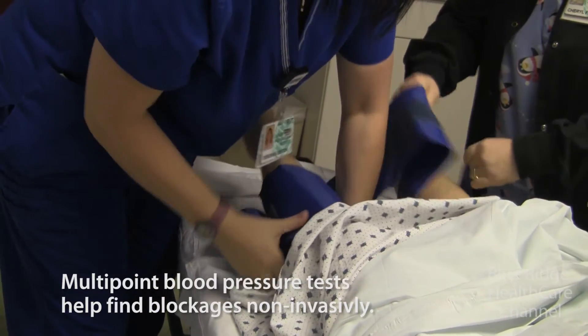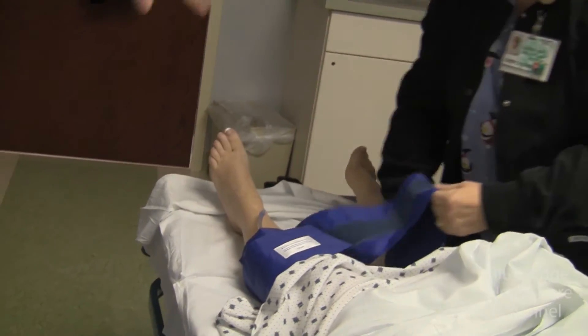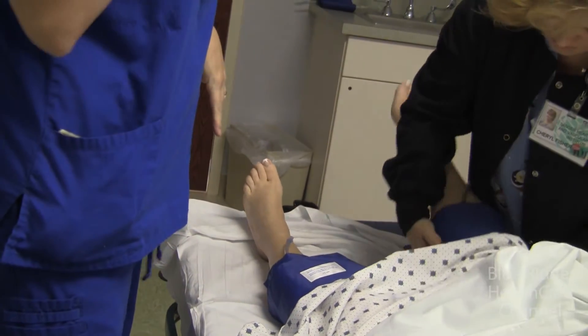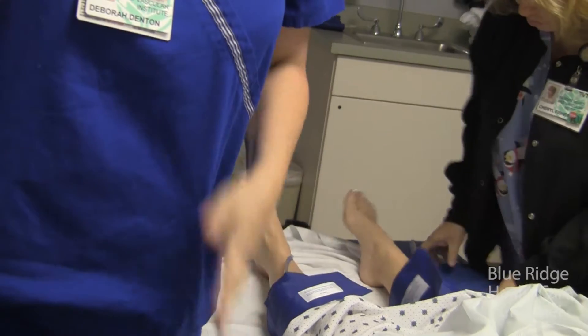Does it depend — if she said she was having trouble in her right leg, would you do just the right, or do you usually do both? We're going to do both and compare them. A lot of the time people have disease on both sides and don't even know it because one side is worse than the other.